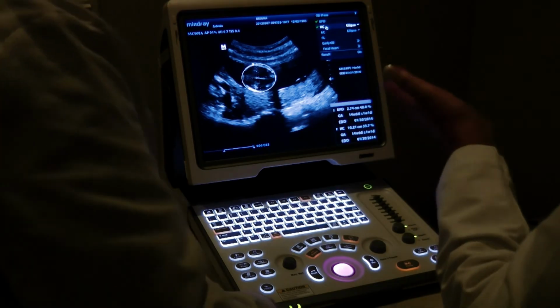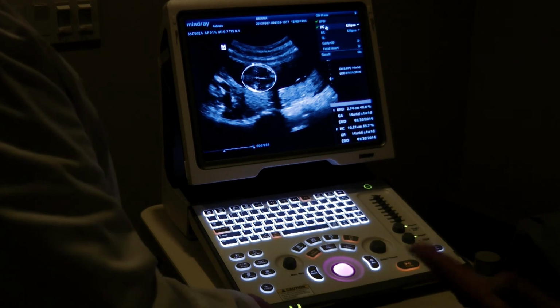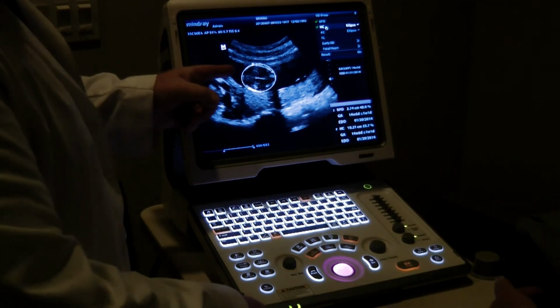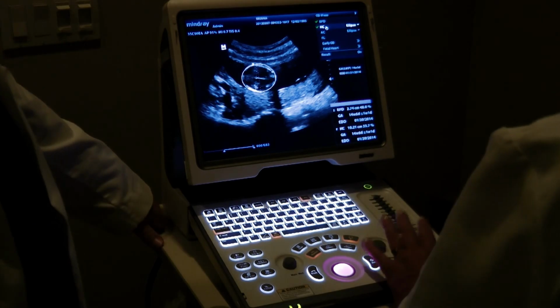Yeah, I like the idea because a lot of the pregnancy centers don't do the head circumference, but there are no extra images involved in doing it. Right. Especially if you have a good parameter. Yeah, it's just another parameter. So perfect. Okay. We'll unfreeze, and I'll give her that picture.